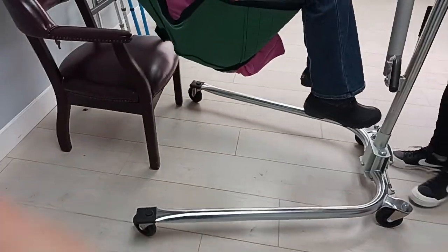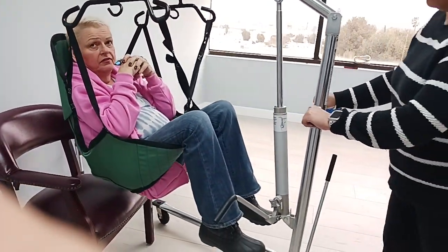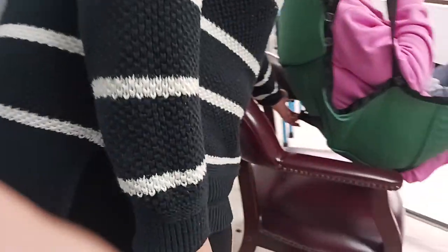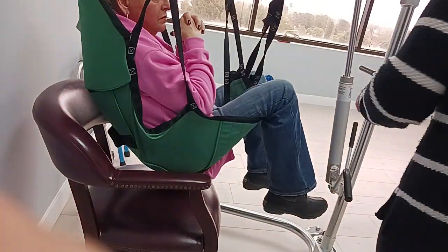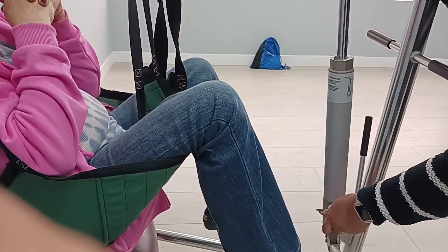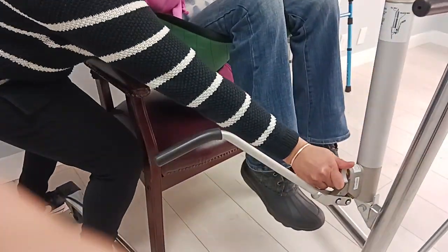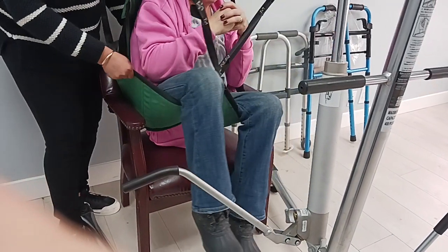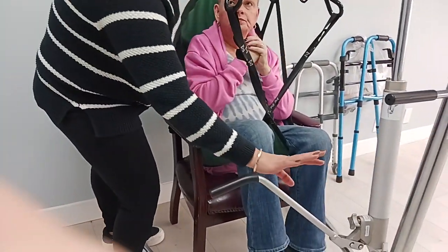So we'll be going to move her — and then we would move her onto the toilet. What I want you to see is her sitting up straight so she can sit on the toilet. In this position she's laying down, and that's why we have this handle here. So you're going to bring her up. When you start bringing her down in order to adjust her — this one kind of sucks because it's very old, it drops you a lot, it doesn't go slow. So you have to do it very slowly, releasing the gas to drop her slowly. I'm dropping her slowly — still not totally down, but enough that it holds her in place while she's being positioned. You can always just let it go down slowly as you adjust.